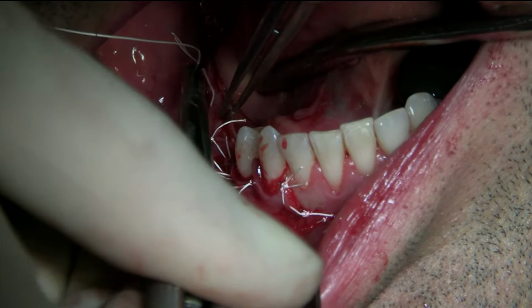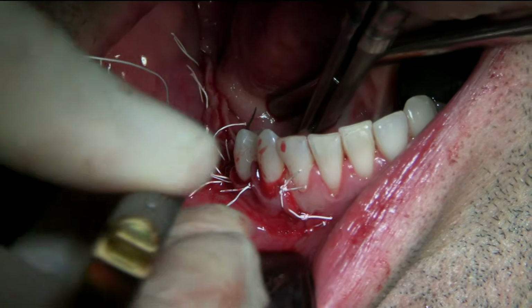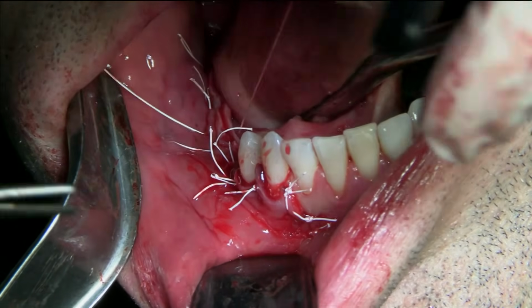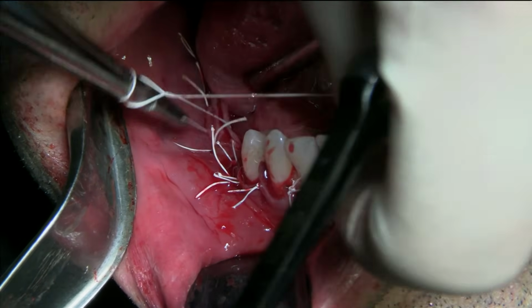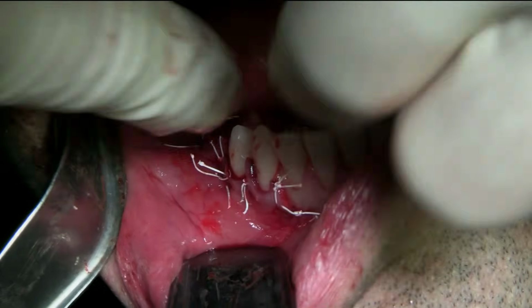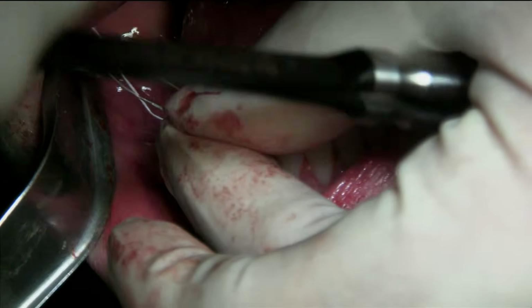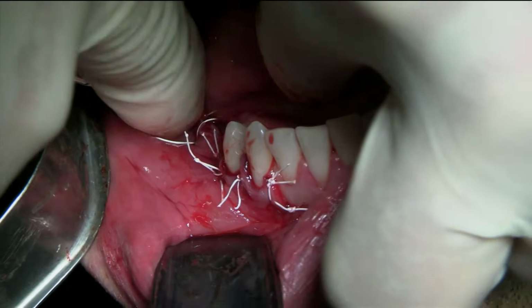So pretty much both situations are similar. Once we see the membrane intraorally, we have to keep it as clean as possible, which means we give the patient an oral rinse with chlorhexidine, and keep the patient swabbing the area, just locally clean. Normally there's no need for antibiotics because there's no infection, it's just a soft tissue exposure.